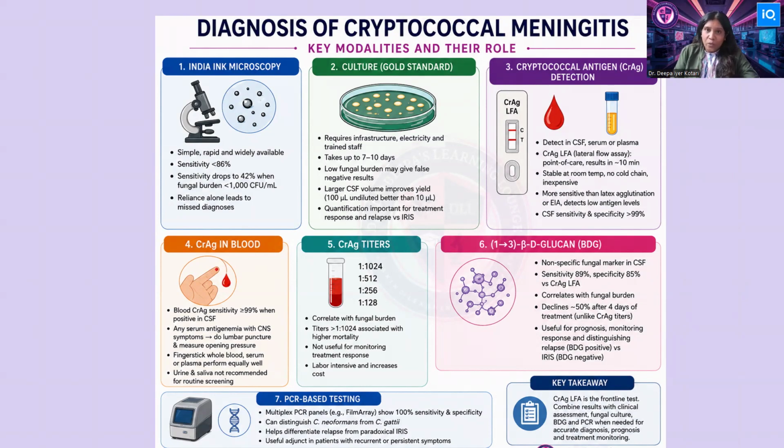First, we generally do India ink for a CSF in India, which is inexpensive and widely available. I will show you a picture of one case of mine in the next slide. So it's very inexpensive, but the sensitivity is about 86% if there is a good fungal load, and it drops to about 42%, especially in immunocompetent patients where the fungal load is low. So are you going to risk that every alternate patient of yours can go undiagnosed? You can't risk it. So India ink should never be used as the sole diagnostic test unless you've already picked up that the load is very high.